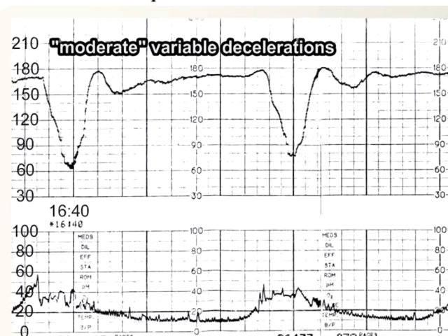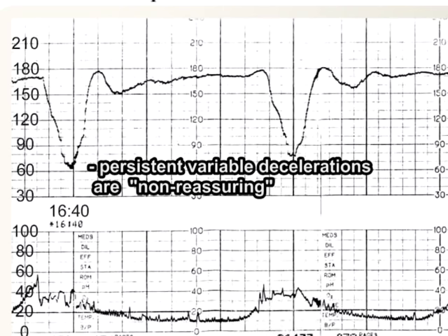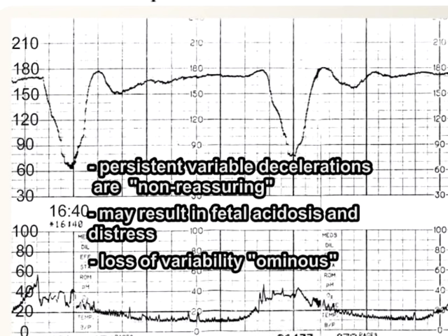Here is an example of a moderately severe variable deceleration pattern, with depth of 70 to 80 beats per minute and duration of approximately 25 to 30 seconds. A persistent variable deceleration pattern in the fetal heart tracing is a non-reassuring sign and may result in fetal acidosis and distress. This particular tracing also exhibits loss of variability. As with persistent late decelerations, loss of variability in variable deceleration patterns is an ominous sign and should prompt immediate corrective measures or delivery.